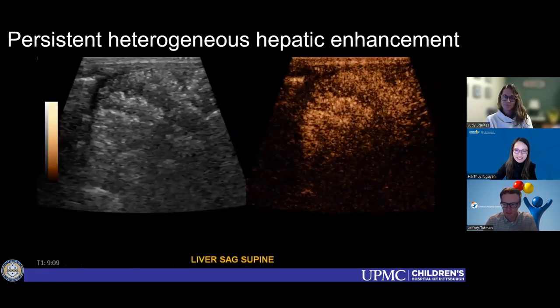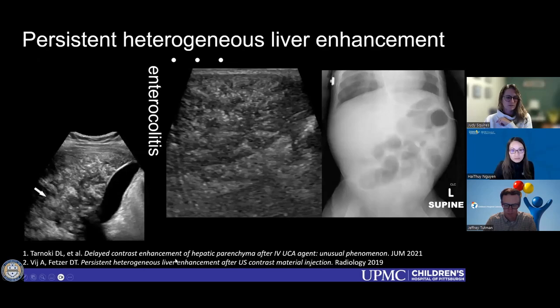So do you usually see it in a specific patient population? I'm thinking with enterocolitis. Yeah, this patient did have necrotizing enterocolitis, and I think in the literature the examples I've seen were some sort of bowel issue. I can't remember exactly. I'll show these references again, and you can go look at them. I've seen it with both of our cases. This kid I don't think actually had necrotizing enterocolitis. It was clinically suspected, but his bowel looked pretty normal at ultrasound, with no complex fluid. We didn't see pneumatosis, but he definitely had an ileus type of picture, not normal bowel.